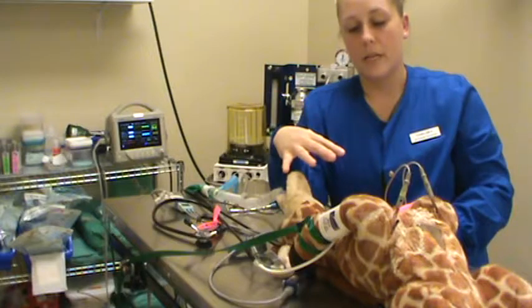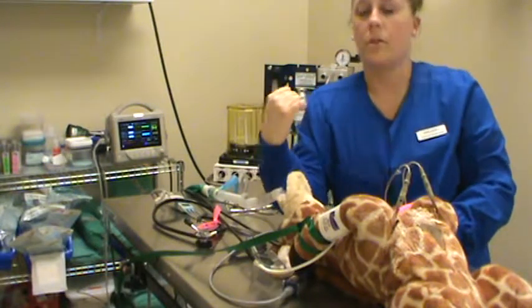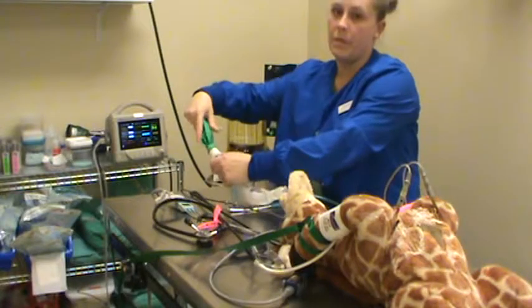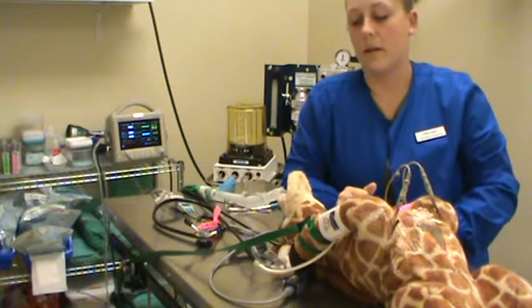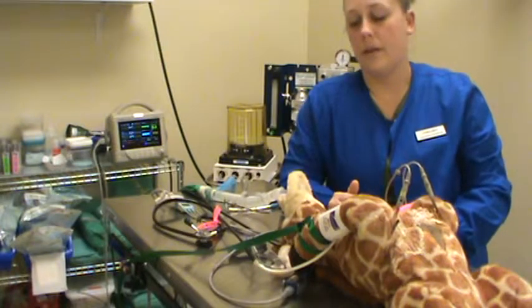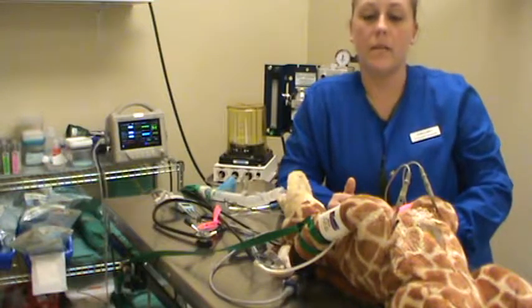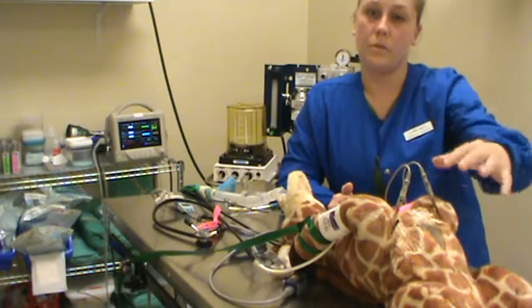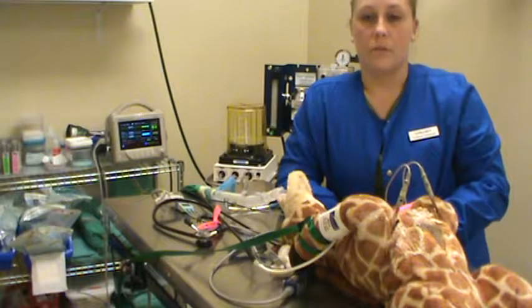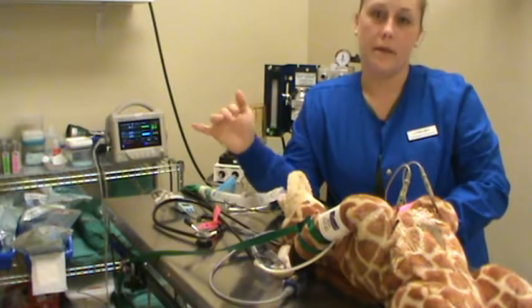So breathing again, just like stage 3, plane 3, we're going to need to assist with the breathing. So we're going to grab our bag and manually ventilate. We're going to watch really closely our end-tidal CO2 and our SpO2 to make sure we're ventilating and oxygenating appropriately, so that they have the right saturation and that they have perfusion to their organs. It's a dangerous level, so at that level you are walking the border of anesthetic death.